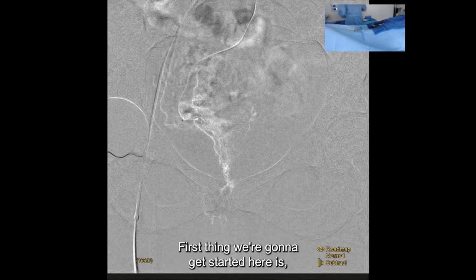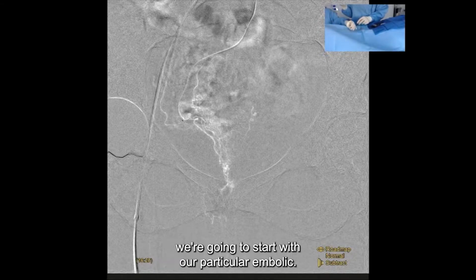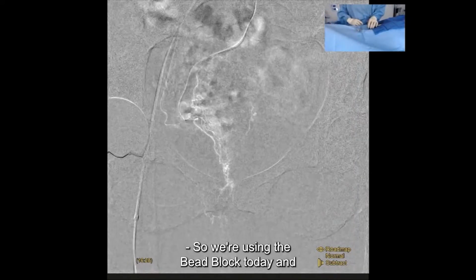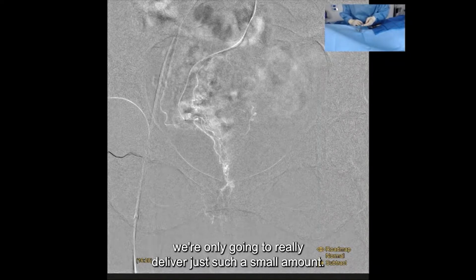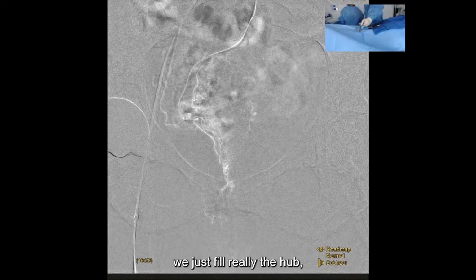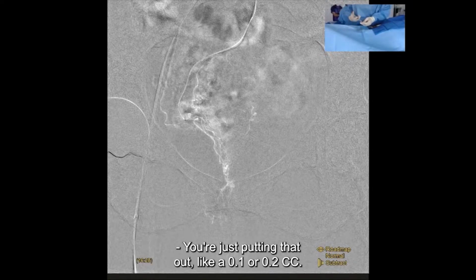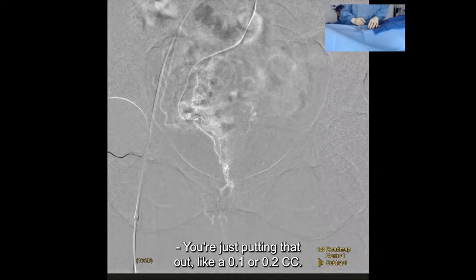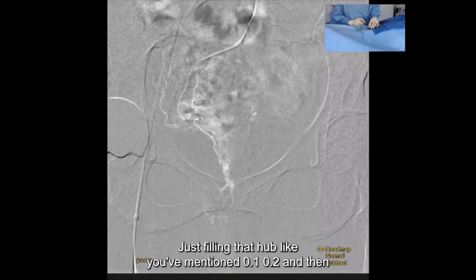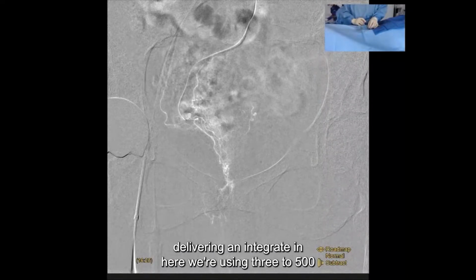First thing we're going to start here, while we're getting that coil ready, is with our particulate embolic. Yeah, so what are we using for embolic today? So we're using Bead Block today, and we're only going to really deliver just a small amount. The reason is we just fill really the hub and then a little bit of the catheter, so you're not even pushing through all the dead space. You're just putting like 0.1 or 0.2 cc. Absolutely. Just filling that hub, and like you mentioned, 0.1, 0.2, and then delivering antegrade.